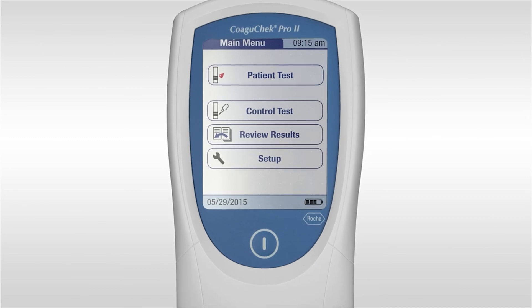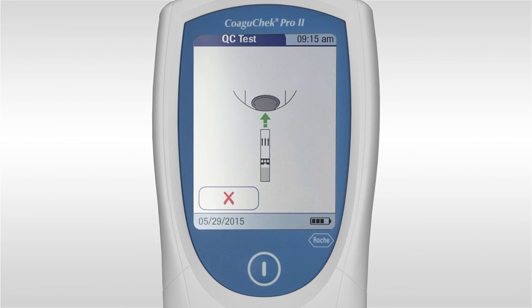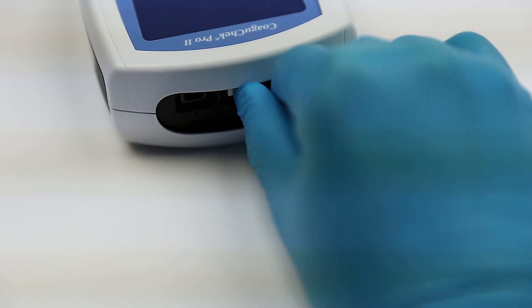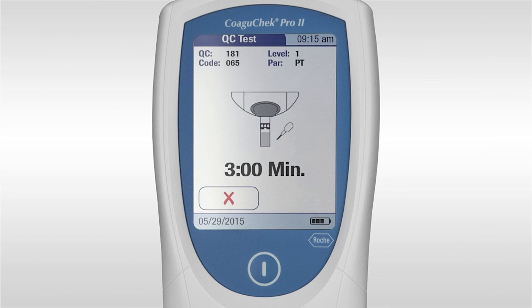After you have prepared the quality control solution, select control test on your device — on the main menu, then select control test on the QC test menu. Only insert the strip when you see the test strip icon. Insert the strip in the direction of the arrows. If the meter has not previously seen this lot number of quality control, you will be asked to insert the code chip that comes with the quality control solution. The hourglass symbol indicates the meter is warming up the strip. The meter indicates it is ready to perform the test when the pipette symbol appears — do not apply the sample until you see this symbol.